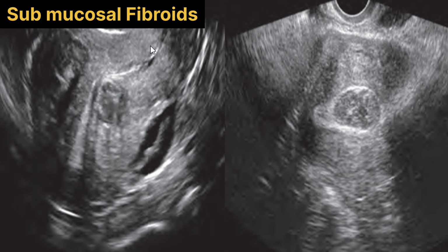Now we are going to discuss the classification of fibroids depending upon their location. First of all, we will discuss the submucosal fibroids. The fibroids which are present in the endometrium of the uterus are called submucosal fibroids. Now this is a longitudinal transvaginal image of the uterus, and it shows a small submucosal fibroid that is deforming the posterior contour of the endometrium. Here we can see the echogenic line which is the endometrium of the uterus, and this fibroid is causing the deformation of the posterior contour of the endometrium.